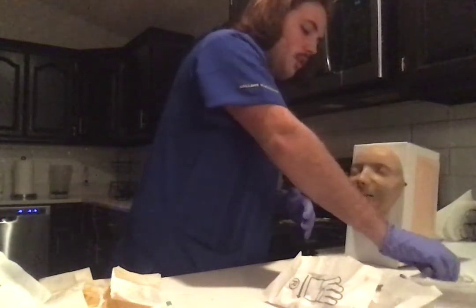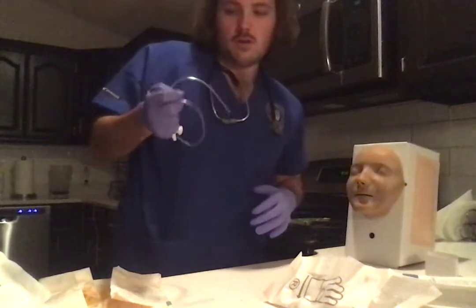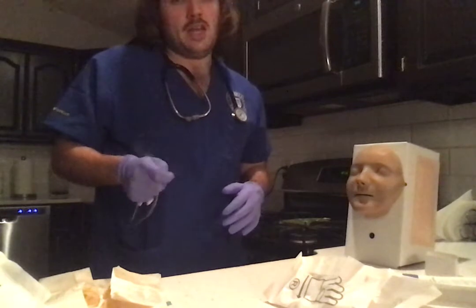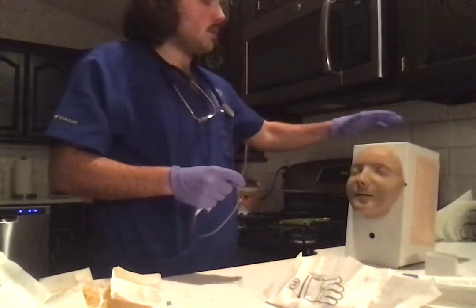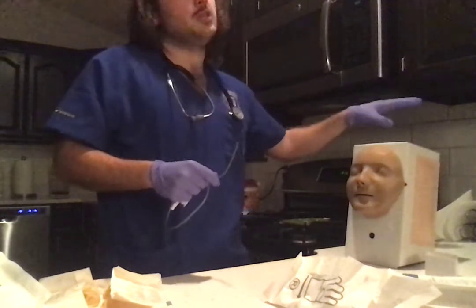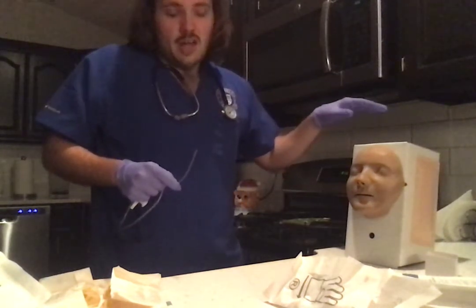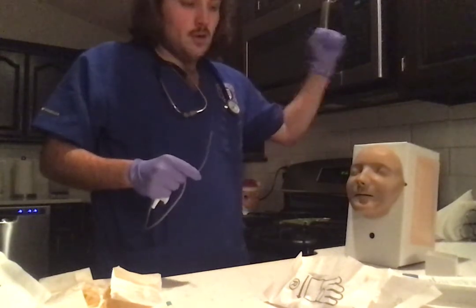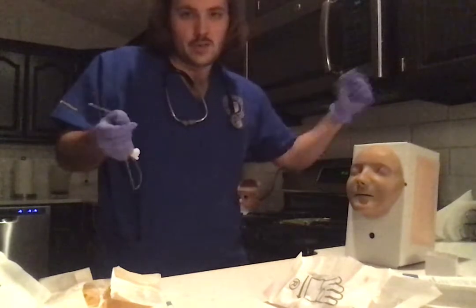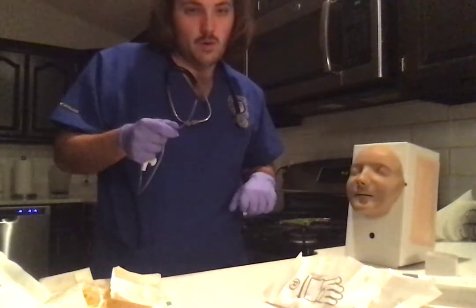So we're going to start by coiling our catheter in our dominant hand. And with our non-dominant hand, we're going to start with the suction. We're going to increase the suction power to 100 to 120 millimeters of mercury. With the non-dominant hand, we would also take the tubing hooked up to that suction, connect it to our catheter, turn on suction, make sure it's working, and move forward.